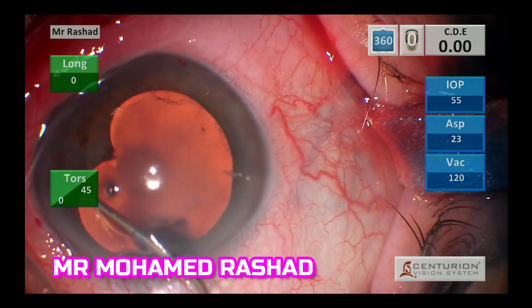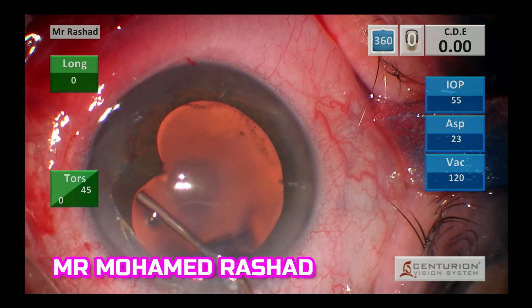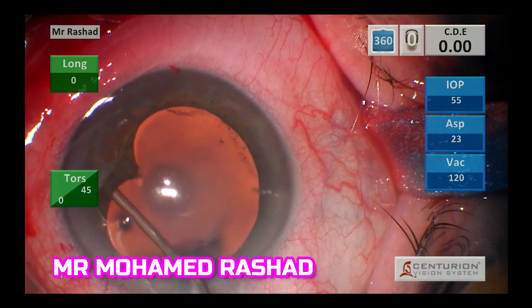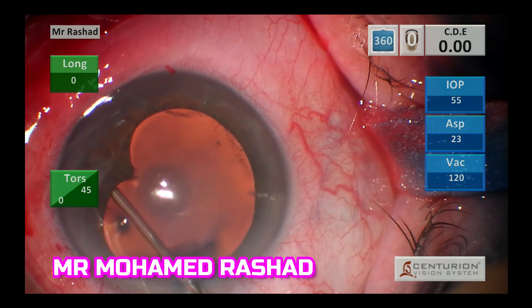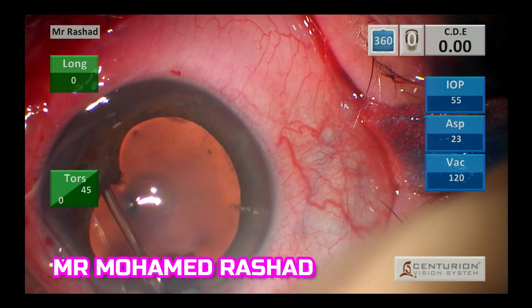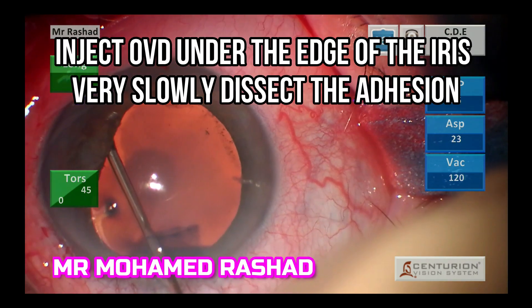Then after injection of Helon GV, I go with the OVD cannula under the iris and inject OVD, mechanically and slowly dissecting the adhesion without injuring the anterior capsule.